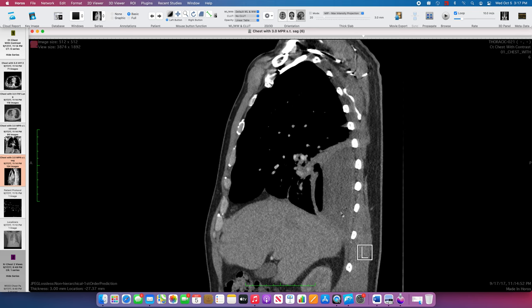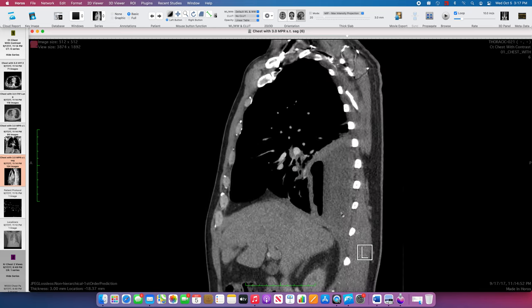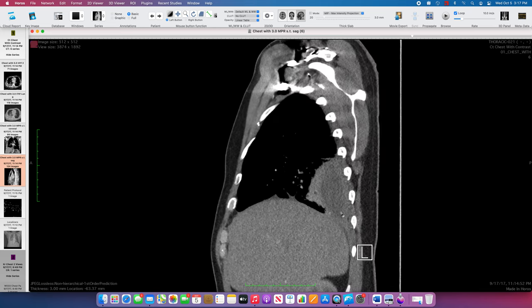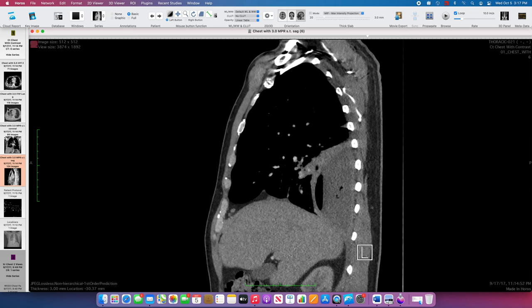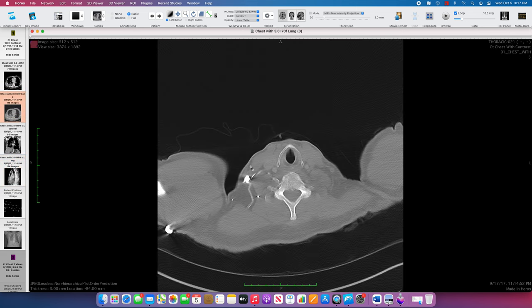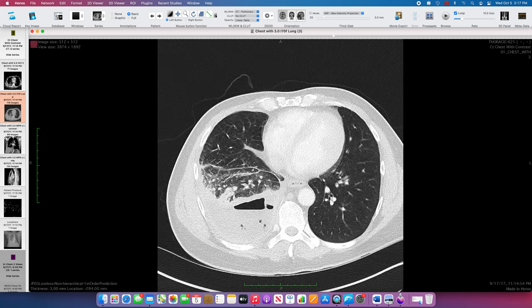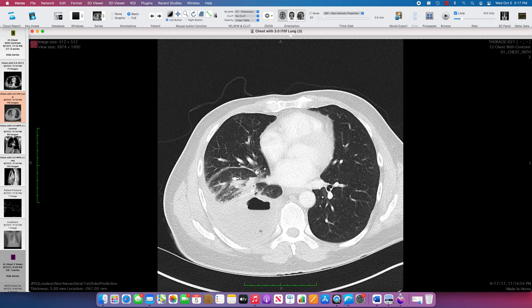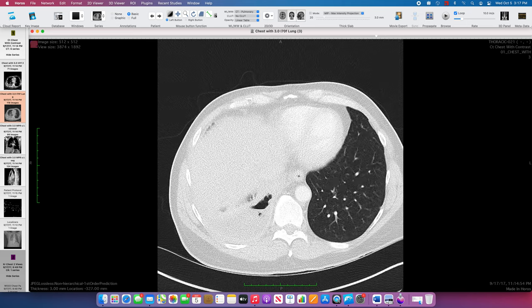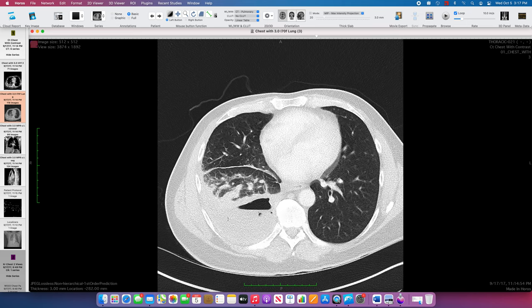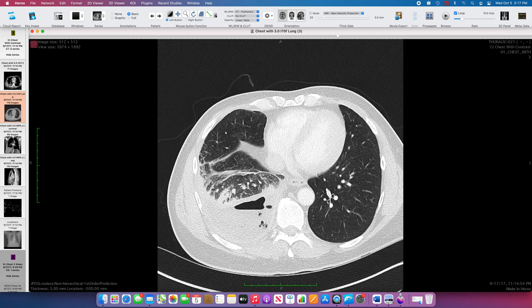This is a large loculated empyema, and although the adjacent lung isn't terribly consolidated, it was likely associated with a pneumonia that progressed into empyema. You have some air filling defects in the airways, some consolidation, and atelectasis. So: pneumonia-associated empyema. Thank you very much.